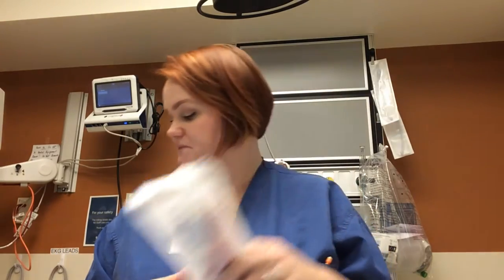The physician also would want you to get some tape ready. We use foam roll tape to secure the chest tube in place, or the chest tube drainage. This is stretchy, so you only need a piece about like that big, and it'll stretch nicely over the chest tube once it's placed, sewn down, ready to go. The physician will either place a 4x4 or an ABD, so that's also in here. And depending on the physician's preference, they even may want a petroleum dressing, and those are also located in the bin.